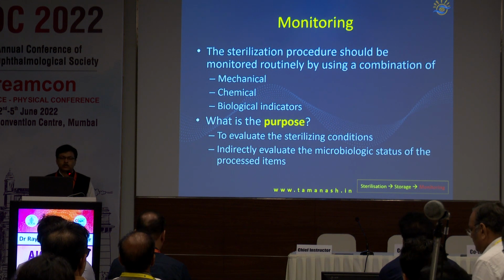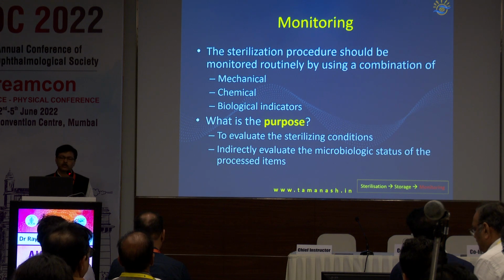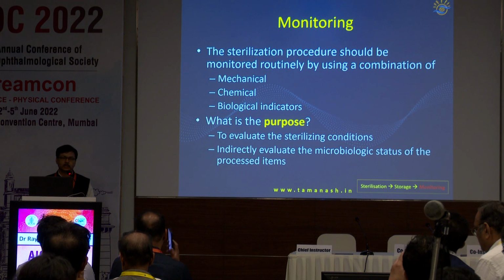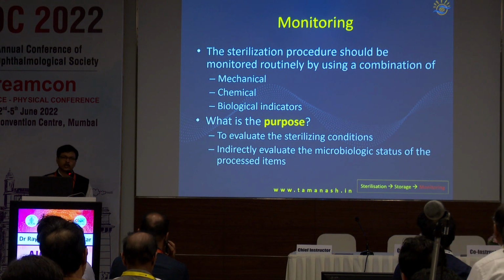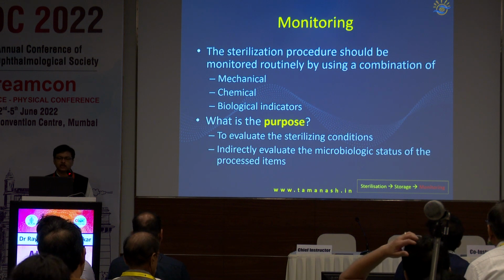Now comes the most important part: monitoring of sterilization. Monitoring is a procedure the purpose of which is to evaluate the sterilization condition and indirectly evaluate the microbiological status of the processed item. Why indirectly evaluate? Because other than doing a culture from the instrument, there is no direct method of monitoring the level of sterilization that you have achieved.